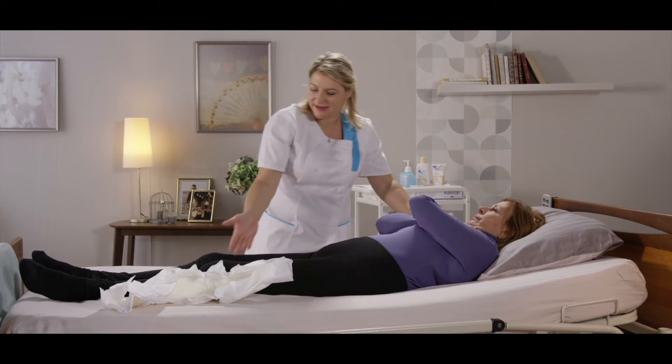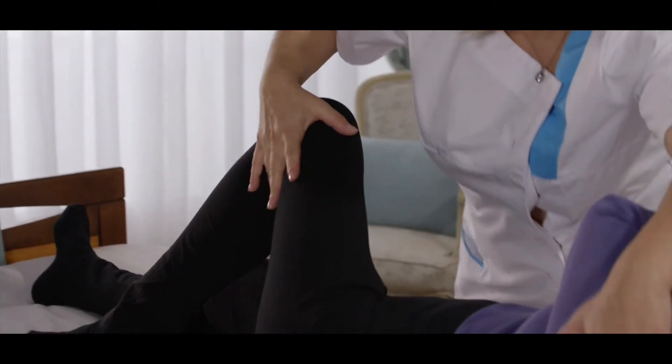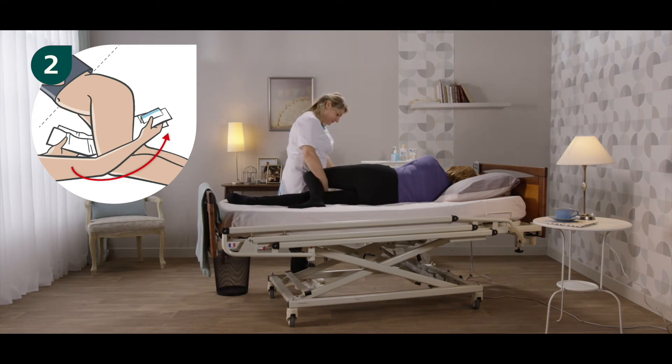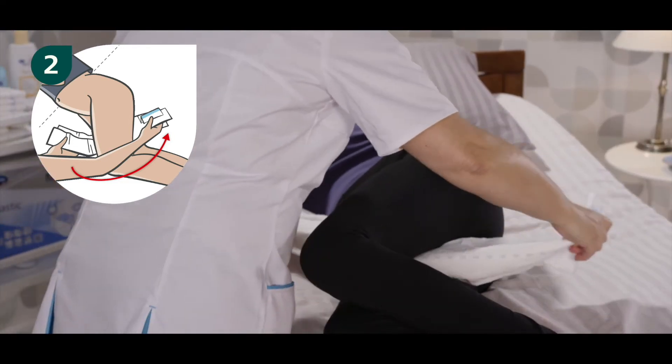Turn the resident onto their side towards you. Step two: place the product on the resident from front to back. Unfold the product in the back and then push the lower side panel underneath the resident.